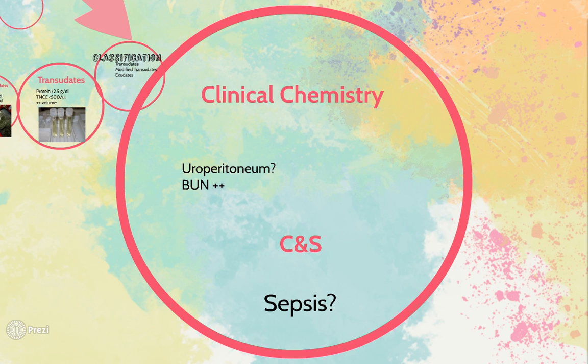So then we could also look at clinical chemistry. So a lot of this fluid that comes out, once we spin it down, we actually can run it through the blood analyzers to get a clinical chemistry on it. And again, that could also measure the protein too, which is helpful in clear fluids. So a couple things that could be associated with changes in clinical chemistry. You might be looking for bilirubin, so to show some hepatic involvement, like a bilious fluid, triglycerides, cholesterol.